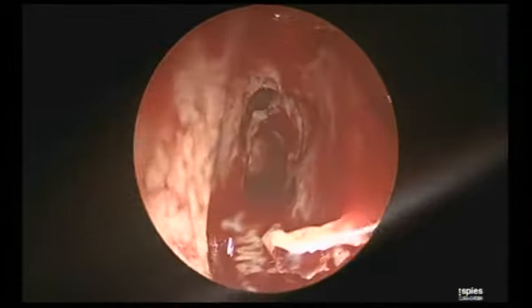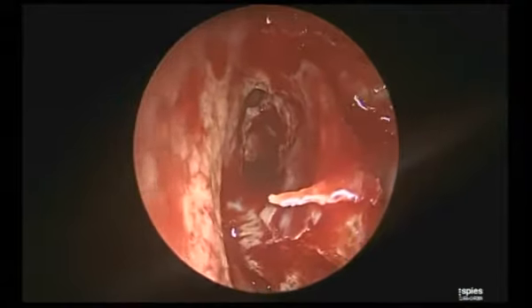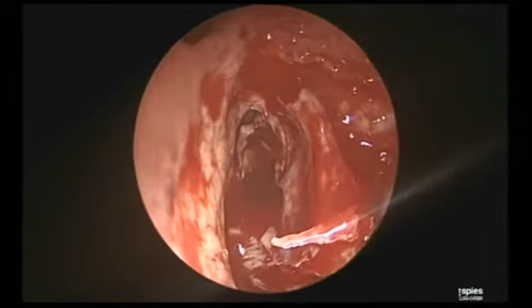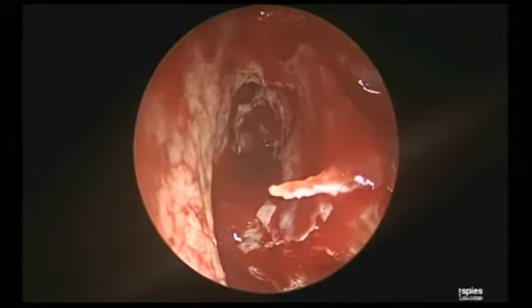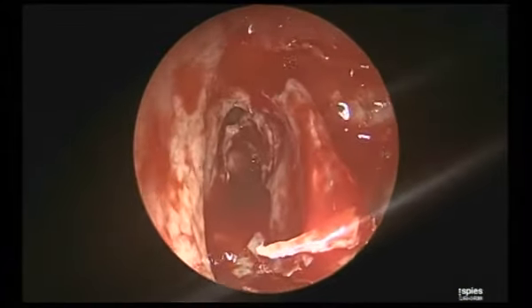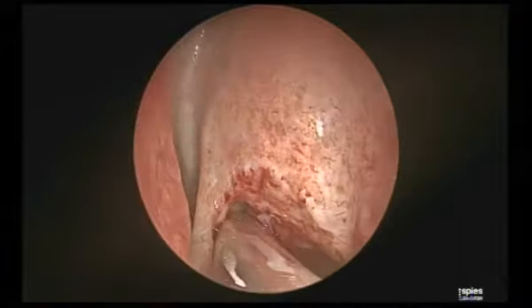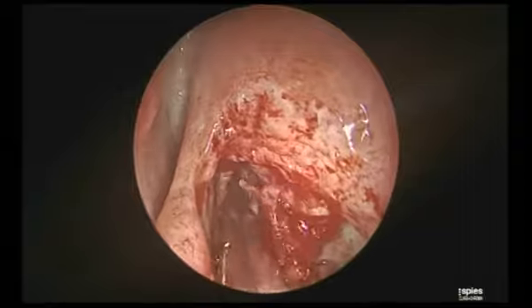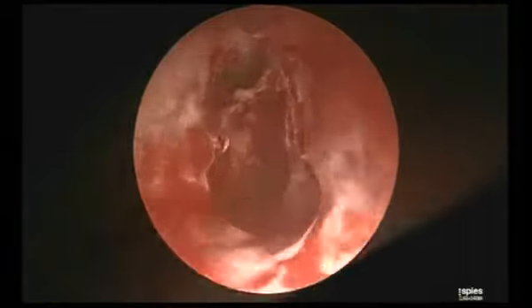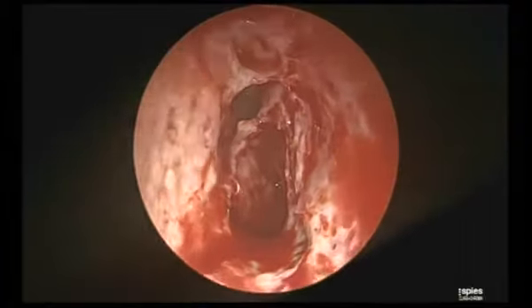I am not interested in looking for the frontal from the beginning. My interest is to keep an eye on the limits. I keep an eye on my middle turbinate and stay lateral to it, and I am sure I am not going to damage anything. Now you can see your frontal up, nicely already. And this is the supraorbital recess.